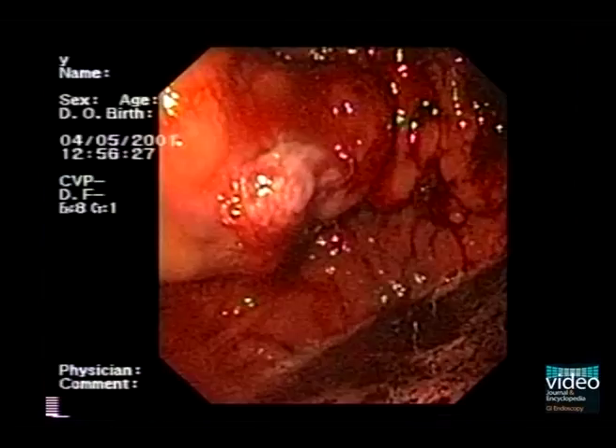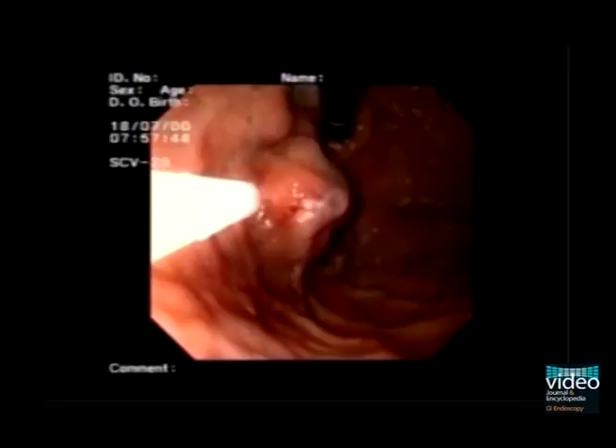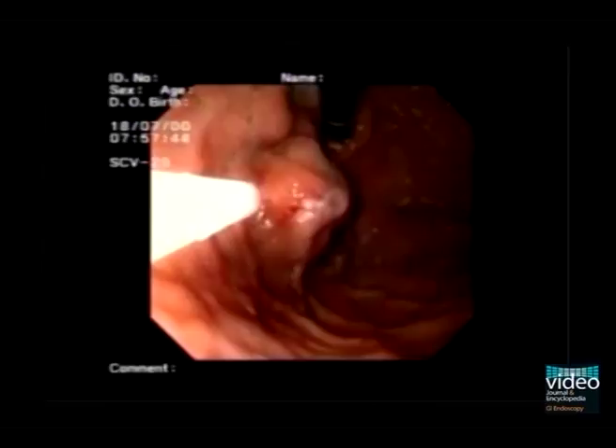This is another case with gastric varices. Again, 1 milliliter of the cyanoacrylate-lipiodol mixture is injected intravariceally. Now we use fluoroscopy for illustration of the obliteration process. Use the catheter tip to probe the varix. The varix is still soft — this signals incomplete obliteration. Therefore, injection is repeated.